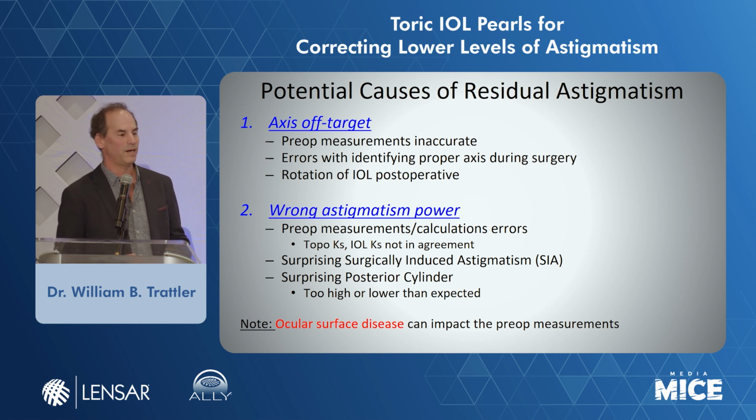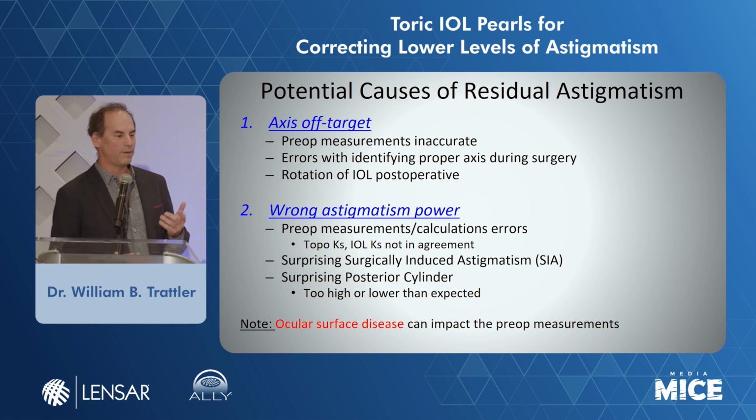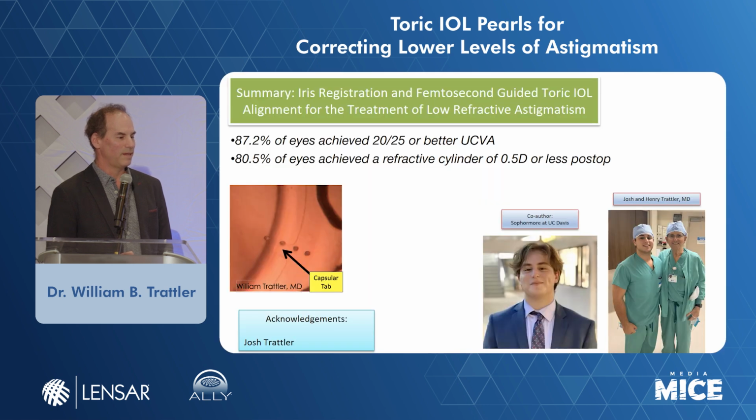Very impressed with Gary's results because sometimes patients end up with dry eye afterwards, so they're not going to end up 20/25 or 20/20 because of dry eye and other issues. One thing I also didn't do is double check a month after surgery that the IOLs were in the perfect orientation, because there's a small chance they could have rotated. But again, because it's a registry, we didn't go back and look to see if any of those that weren't quite perfect had rotated a bit. And obviously, as I mentioned, we have to look at the ocular surface.